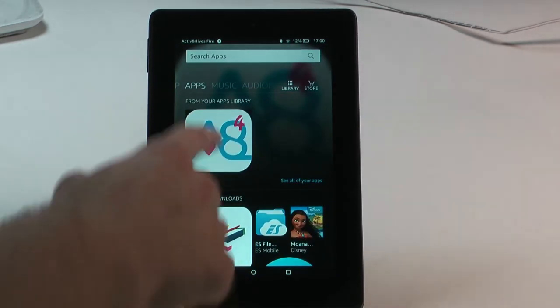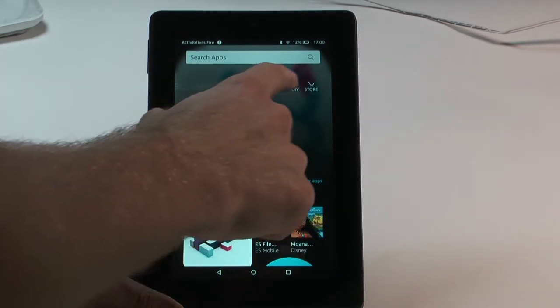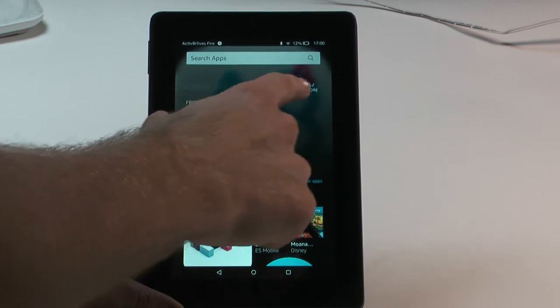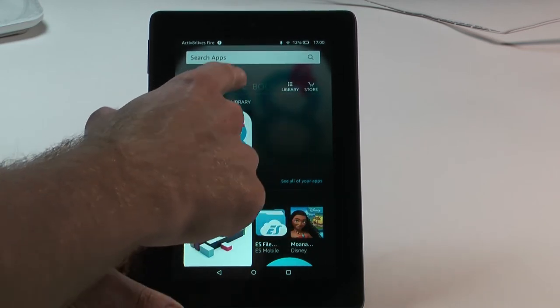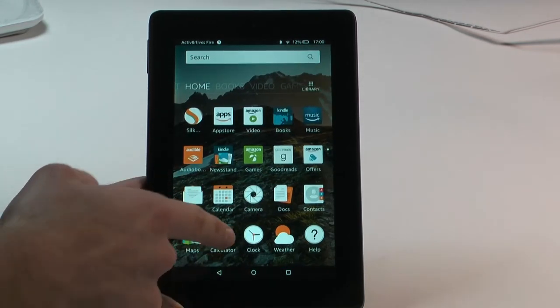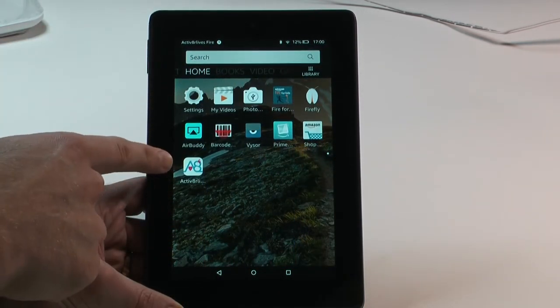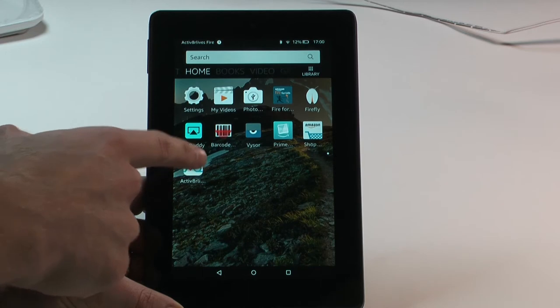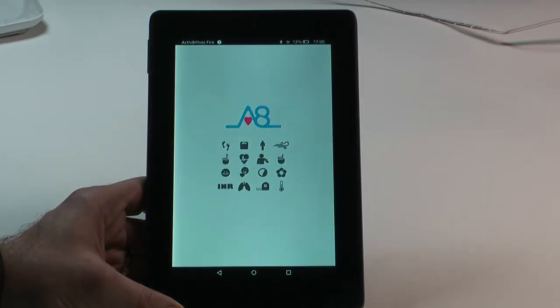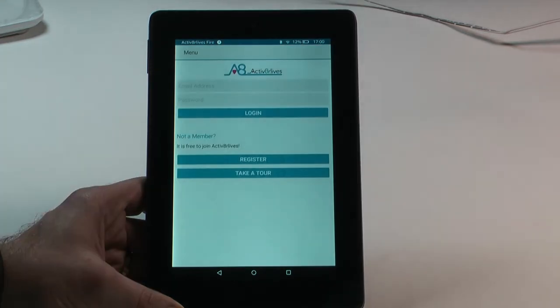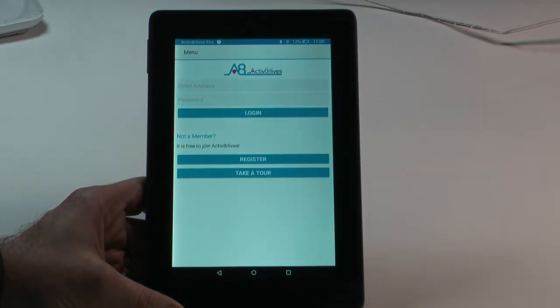If you go back to the home page, you can see that the Activate Our Lives app is there. If you've already registered, login using your email and password, or if you're new to us, go to the Register tab.